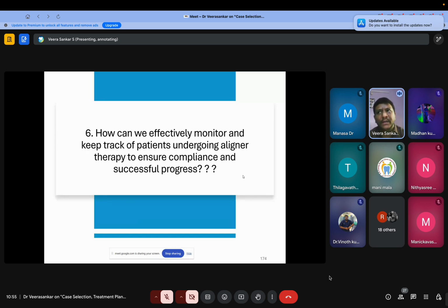If you doubt that the patient is not wearing the aligner properly, and you say that, sometimes they will end up in arguments saying that they were wearing it properly, but the system is not working. In those cases, you can go ahead with the progress assessment. You can ensure the position of the teeth with the particular aligner number, match it with the routine treatment plan, and exactly tell them where the actual problem comes. It is not about pinpointing the problem to the patients. Rather, we can find out the solution with the progress assessment tool.